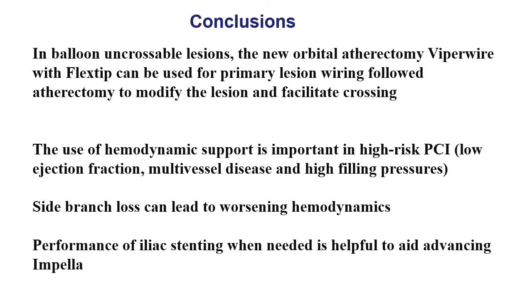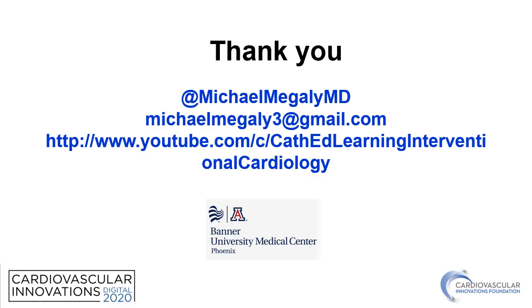And finally, iliac stenting can be helpful to aid advancing Impella in patients with severe iliac disease. Thank you so much.